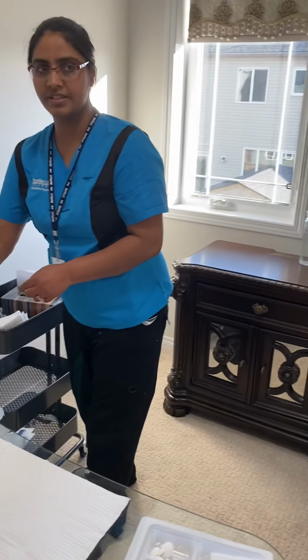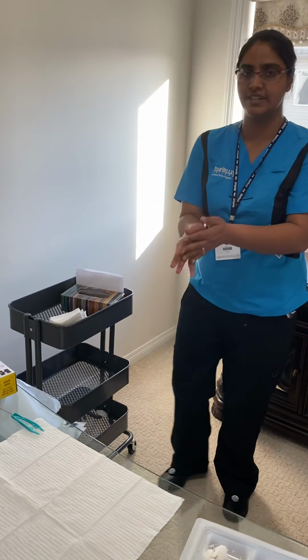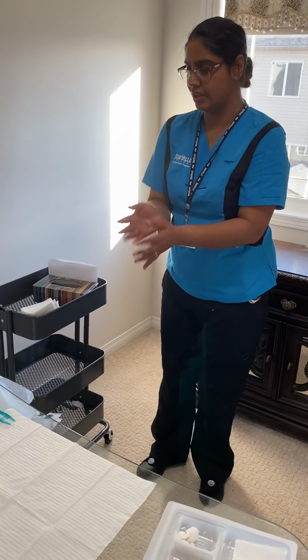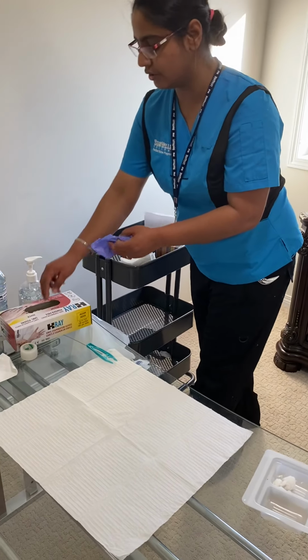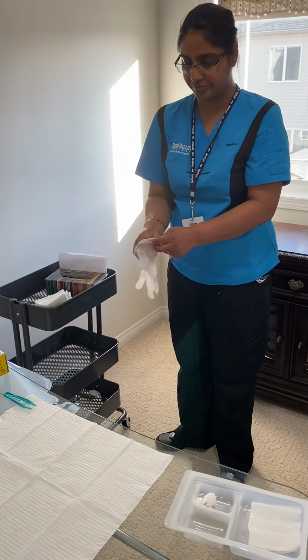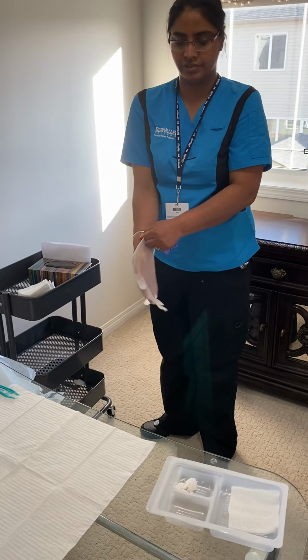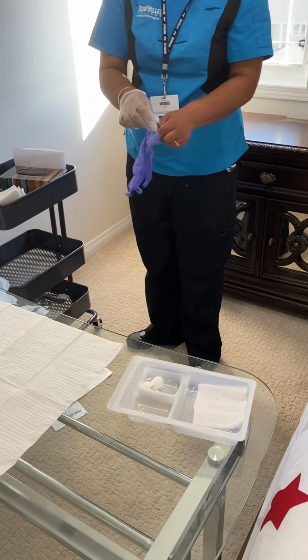Now the next step is to sanitize my hands with hand sanitizer for 30 seconds. And I'm going to put on my gloves. I'm constantly keeping eye contact with my field. I'm going to wear the gloves for the staple removal.